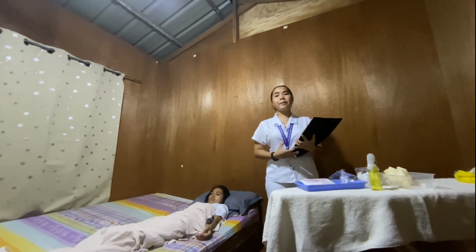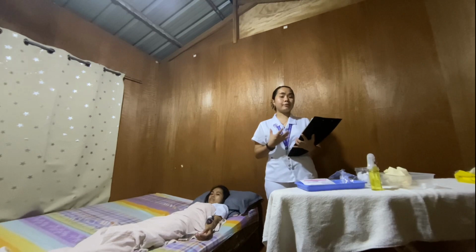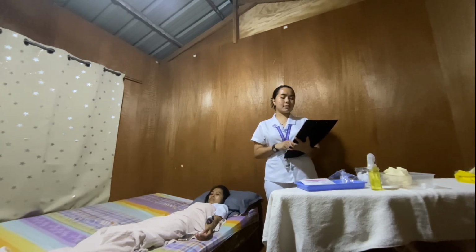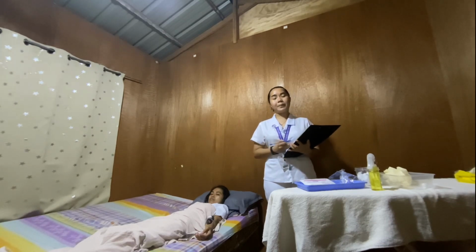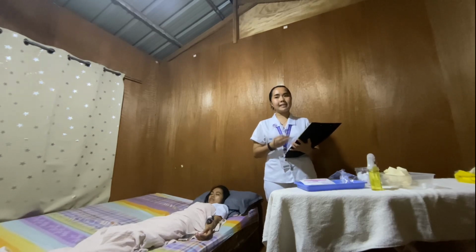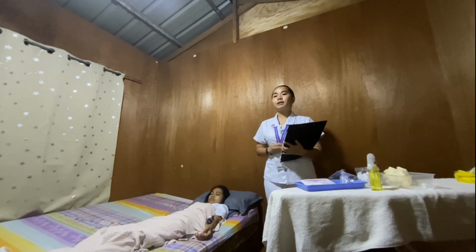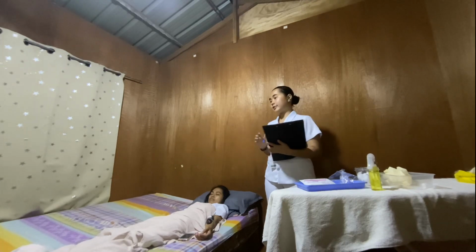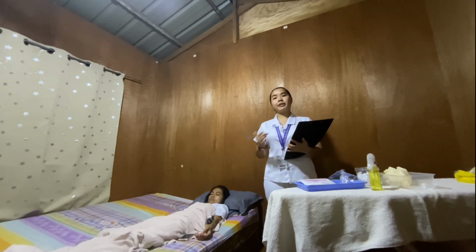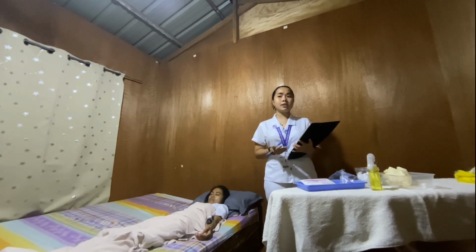Next, it is also important to document all relevant information: record the testing material given, the time, dosage, route and site, and also the nursing assessment, because this will help us to ensure that the procedure has happened. Next is to evaluate the condition of the site after 30 minutes depending on the test, and also measure the area for redness and induration in millimeters at the largest diameter and document the findings.